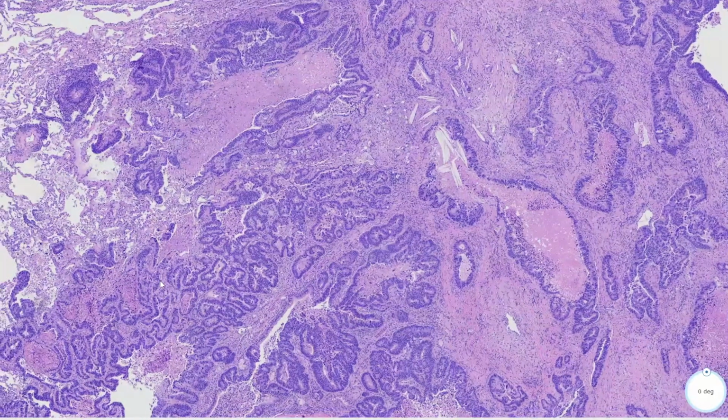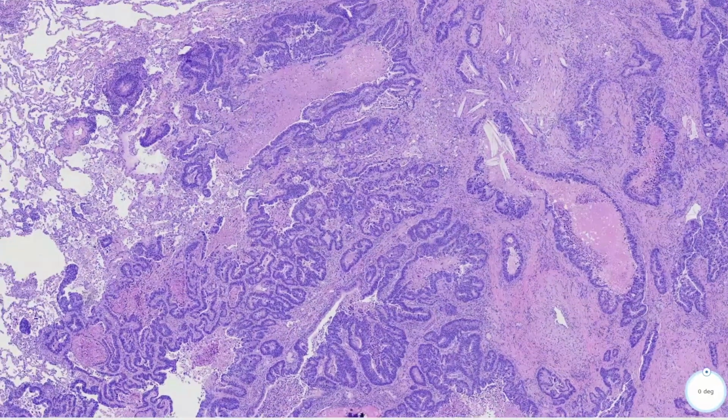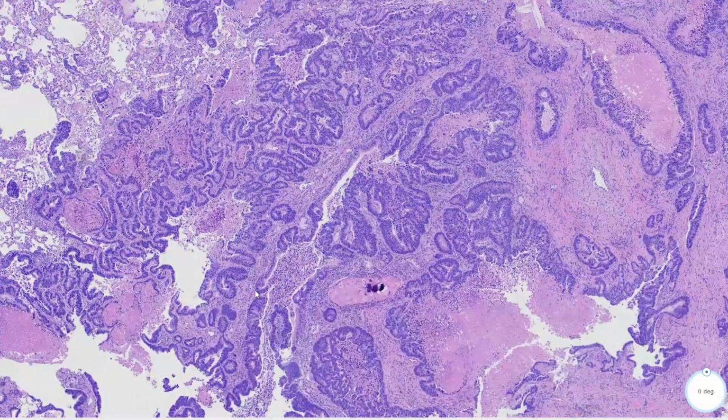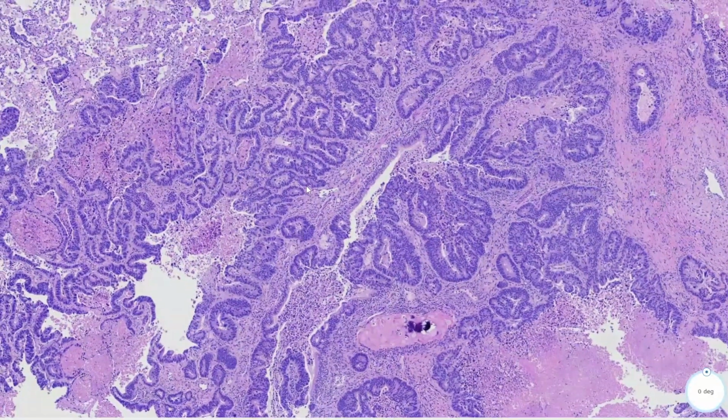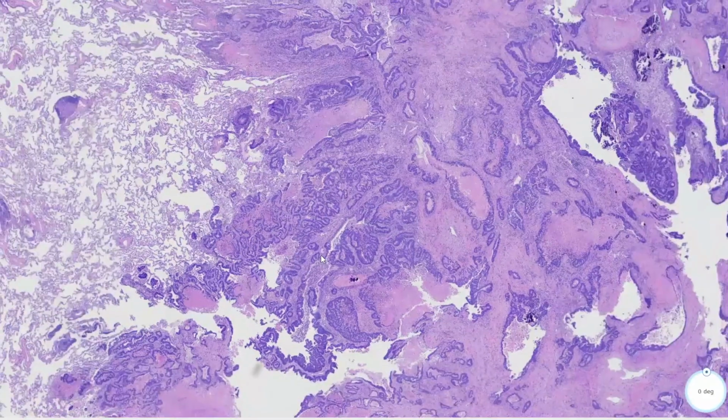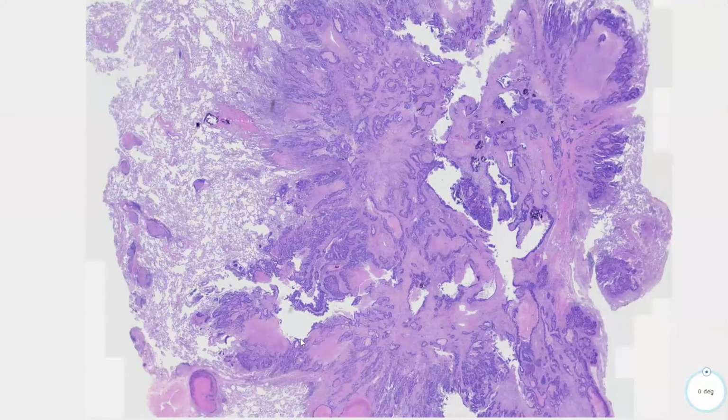In terms of some information around metastasis, metastases are often the most common pulmonary malignancy we see. If we look at an autopsy series, the lung is the third most common site for metastasis after lymph node and liver. Common metastases that we see in the lung include GI, breast, and head and neck, and you can also see metastatic sarcomas and melanomas. Classically, at low power, these will be cannonball-like lesions, which are well circumscribed, and that's how you'll see it on gross as well.